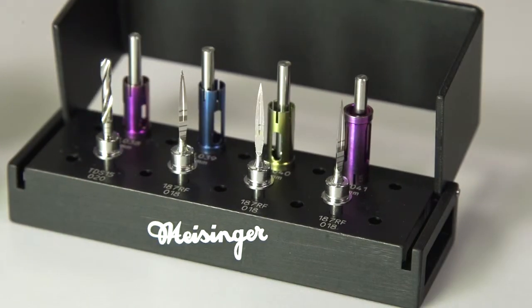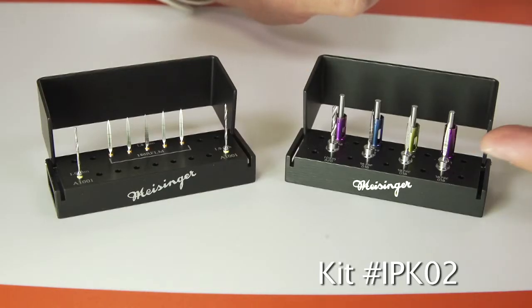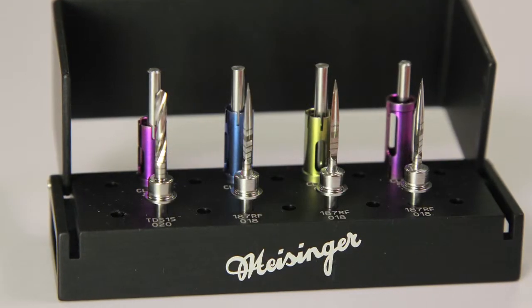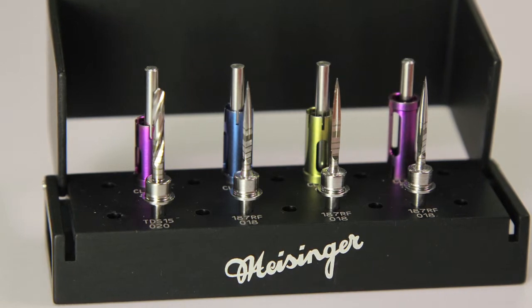The other kit is the Implant Prep Kit 2, which is the IPK-02. It's the same bayonets with a 2.0 millimeter twist drill and three bayonets, but this kit offers the depth stops of both 5, 6, 7, and 8 millimeters.